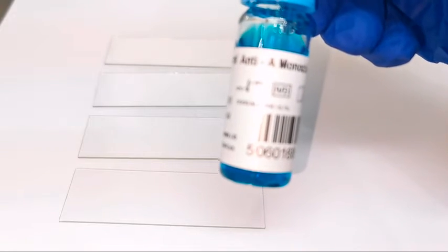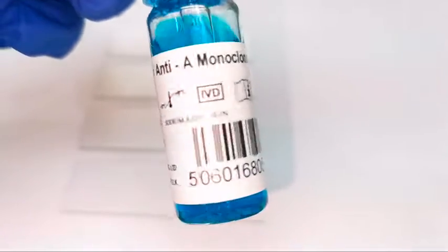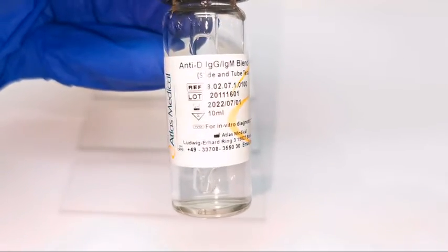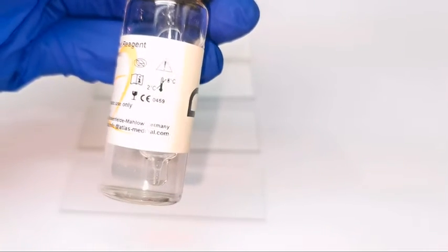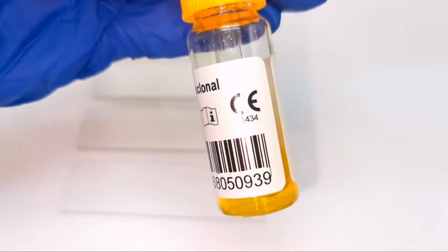It's time to bring out the antisera now. We must make sure that it is at room temperature before we use it. This is the anti-A. It will agglutinate blood that has A antigens. This is the anti-D. It will agglutinate blood that has D antigens. Lastly, this is the anti-B. It will agglutinate blood that contains B antigens.